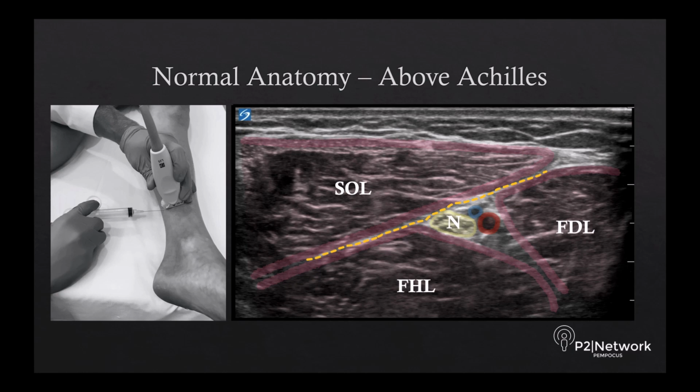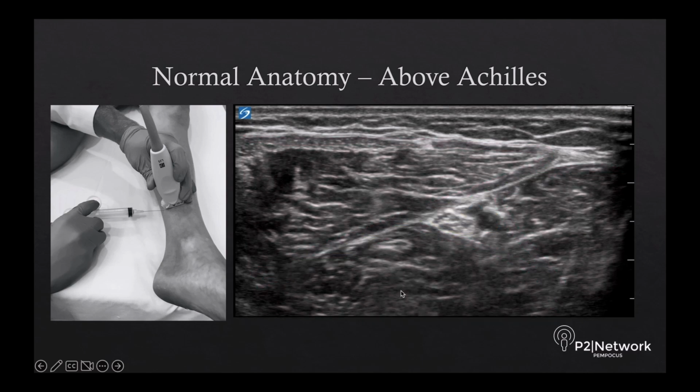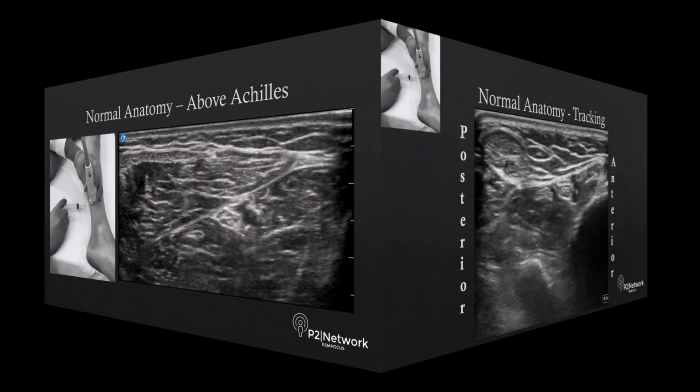It's within this fascial layer that the posterior tibial neurovascular bundle sits, and our ultimate goal will be to insert our needle just within that layer to allow our anesthetic to spread up and around and bathe the nerve. Removing these labels, you can see the anatomy again here.